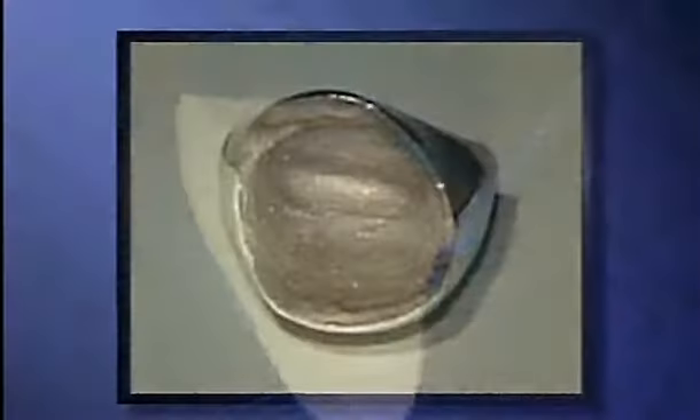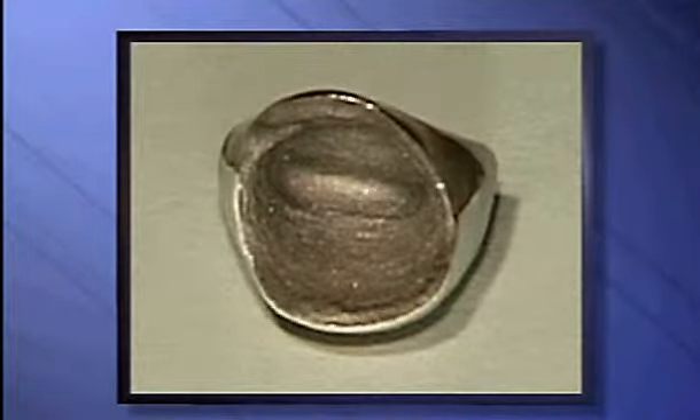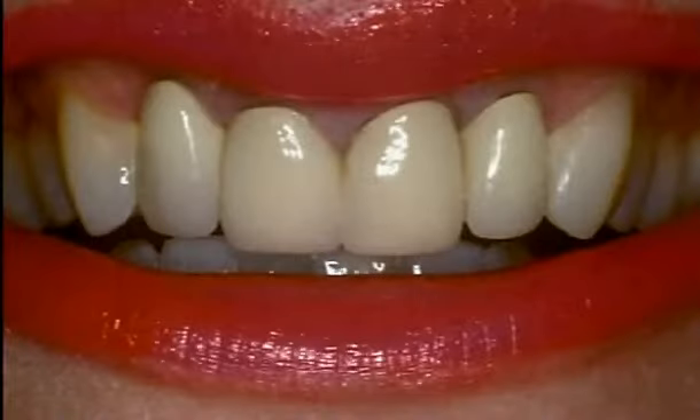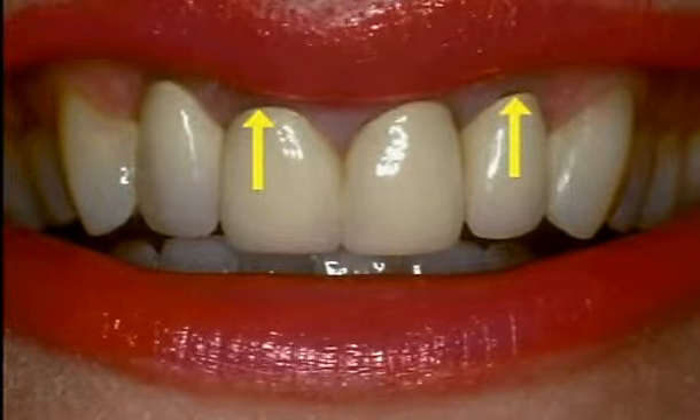To have enough strength to withstand biting forces, porcelain crowns used to always be built upon a metal core. If you've ever noticed a dark blue line at the edge of a crown, now you know what caused it — the dark metal inside the porcelain.